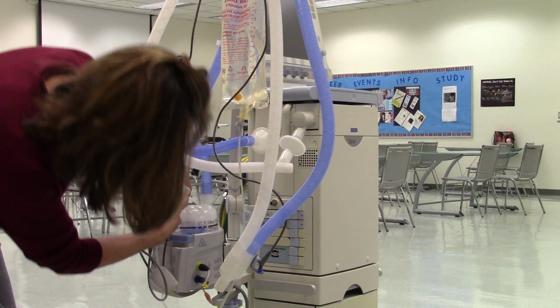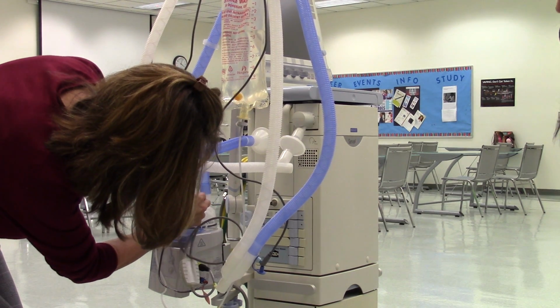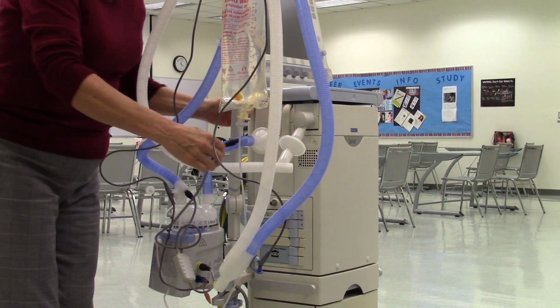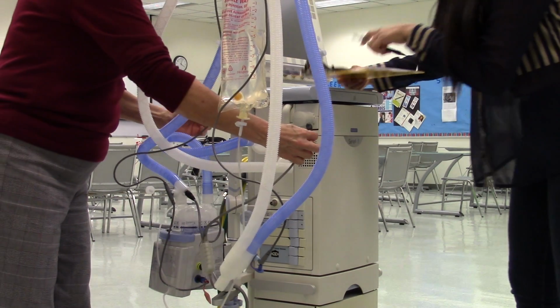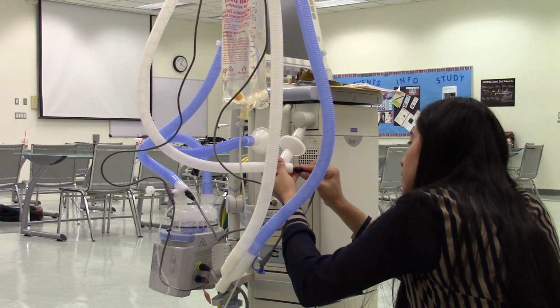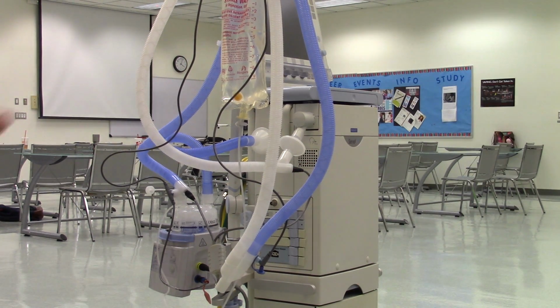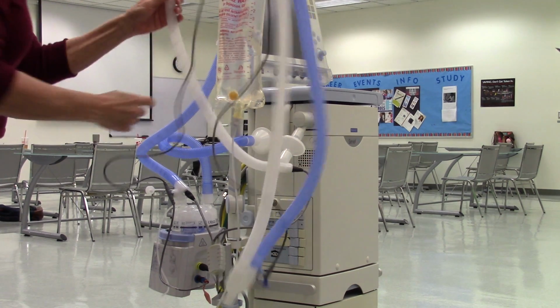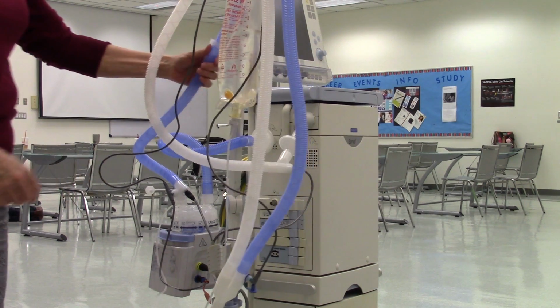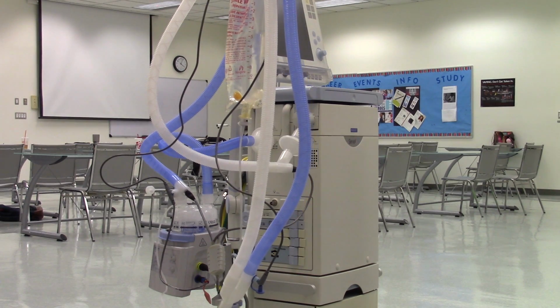One of them goes here. That's not a one. And I push straight in. The other one goes on the expiratory side. Yes. Perfect. So now this cable will heat the wires on the expiratory side. And then this other cable will heat the wires on the inspiratory side. The wires that are inside are what's heated. Yes, it heats up. Oh, okay.